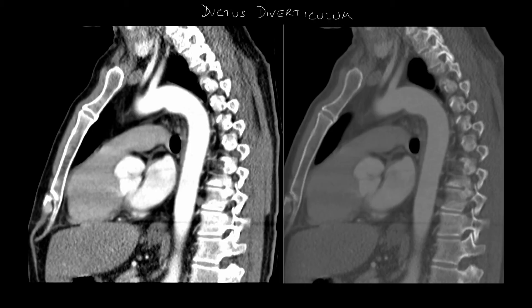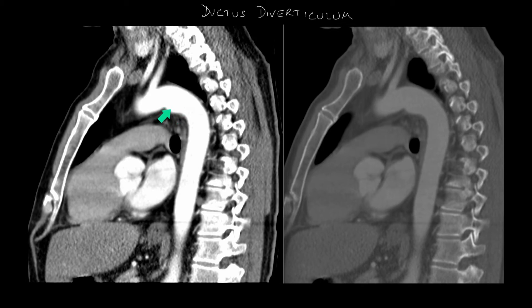This patient, on the other hand, has ductus diverticulum. Unlike a pseudoaneurysm, this has an obtuse angle with the wall of the aorta and is more anteriorly placed than a pseudoaneurysm.